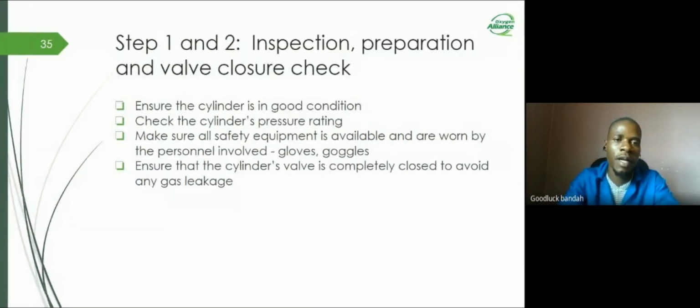Let's start with steps 1 and 2, which is inspection, preparation, and of course, valve closure check. In this, you have to ensure that the cylinder is in good condition.